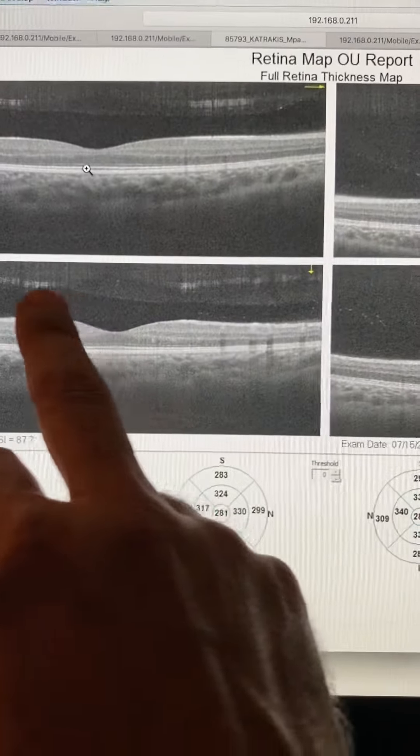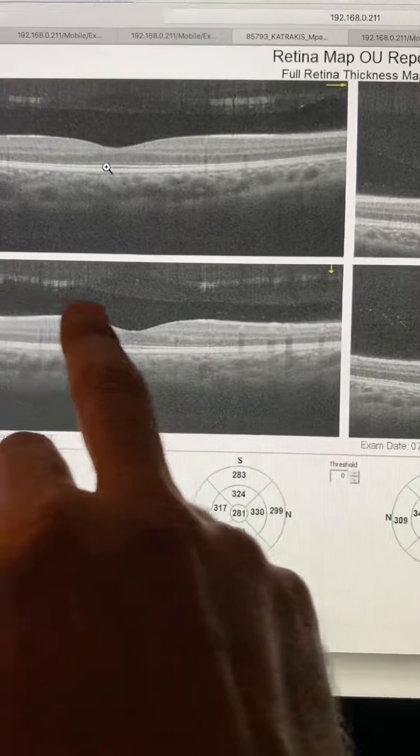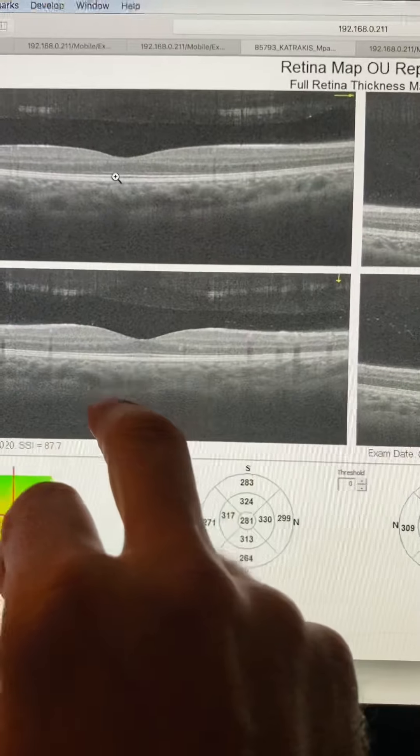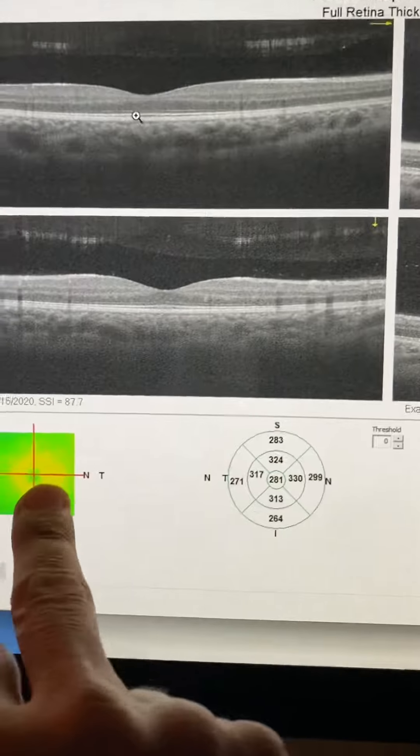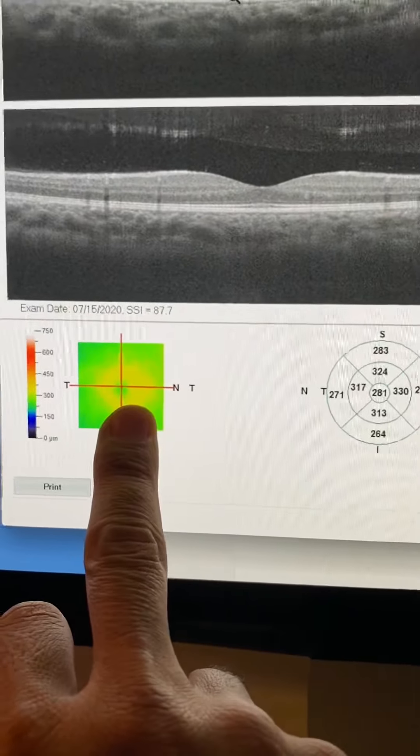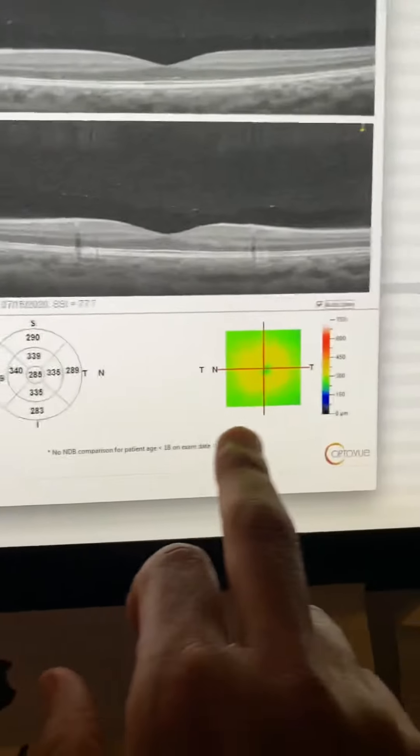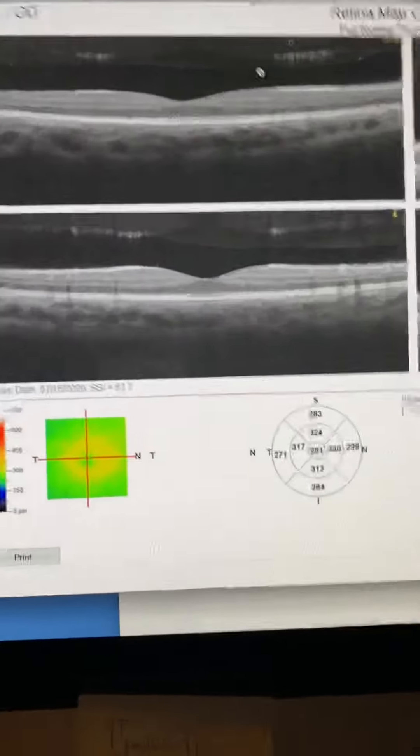This is the macula. Interestingly enough, the right macula patient already has a PVD. But the macula is fine, and the macula thickness is fine: 281 in the right eye, 285 in the left eye.